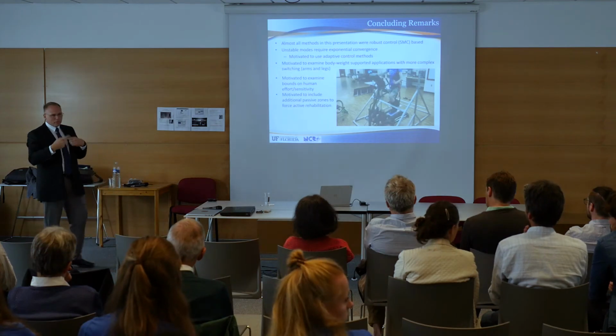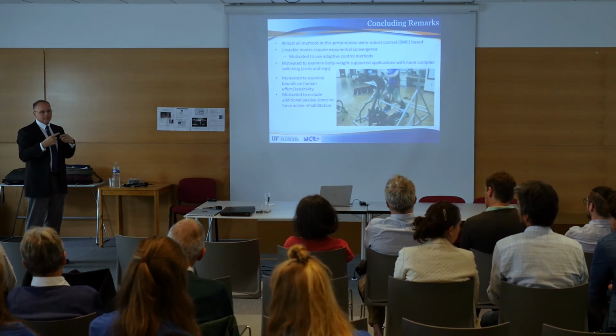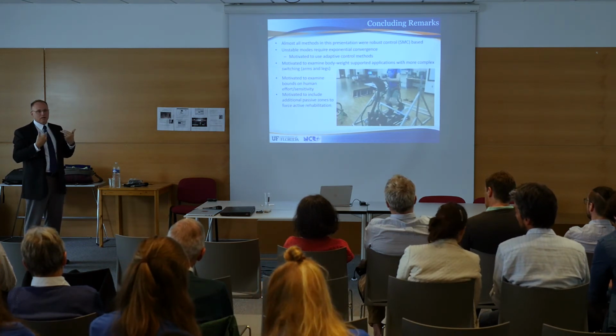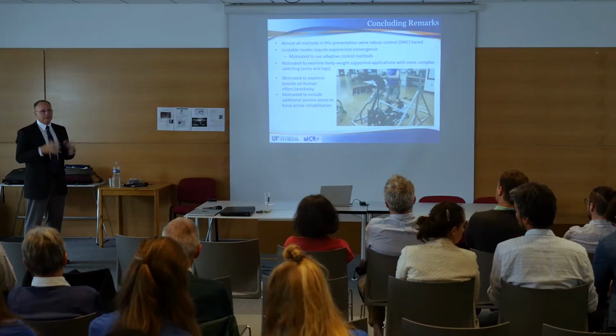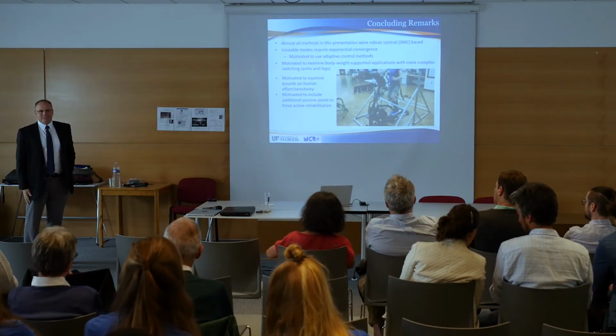And so, even to your earlier comments about when to cut on and when to cut off different muscles, we found that because of the delay, you may want to start cutting on a muscle preemptively so that when you want the muscle to be on, it will be on. And likewise, you may want to cut it off a little early so that when you really want it off, it will be off and not fighting against other muscles. We're doing studies now characterizing the delay throughout the crank cycle with individual muscles, and we're working towards that goal now. So that is the end of my presentation.